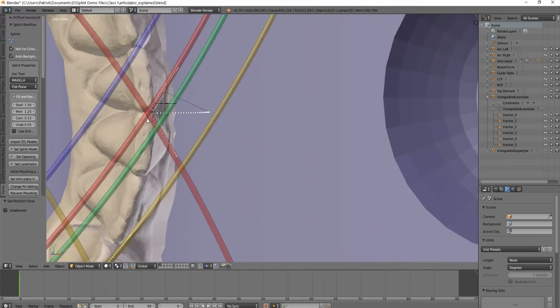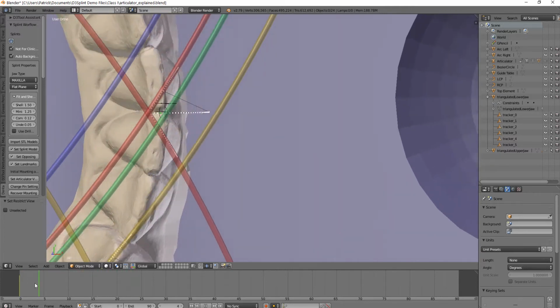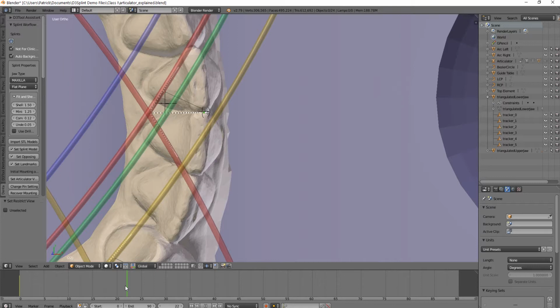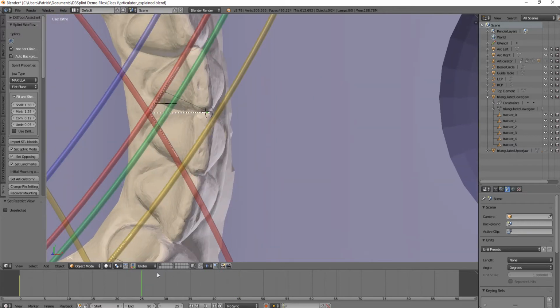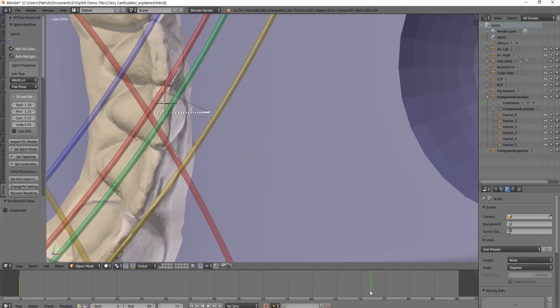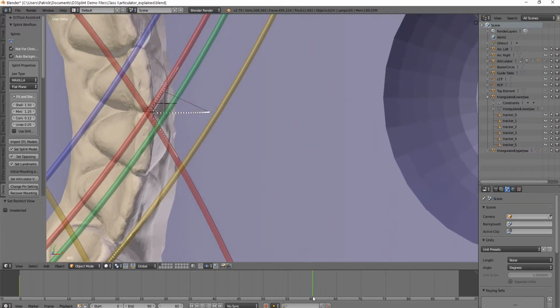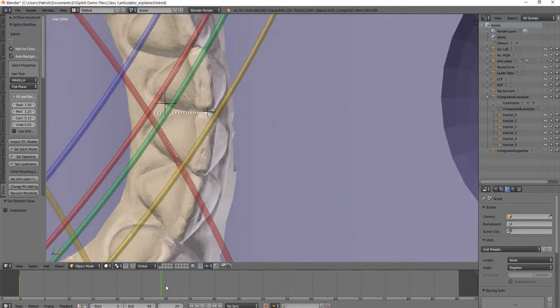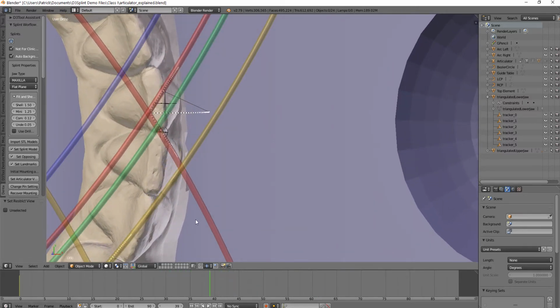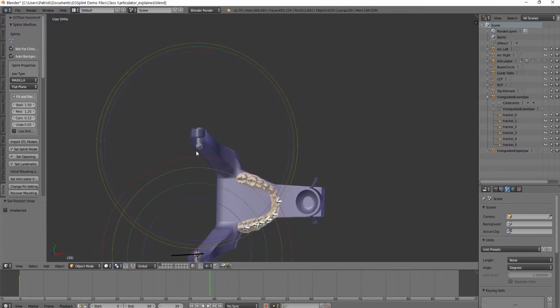We can examine these trackers and see that in the front, where there's just protrusion, we have a straight line going forward, which makes sense. And then in our right and left excursion, and let me slow that down a little bit so it's not so choppy in the video. So in our left excursion and our right excursion, the tracker falls within the arc of each condyle.